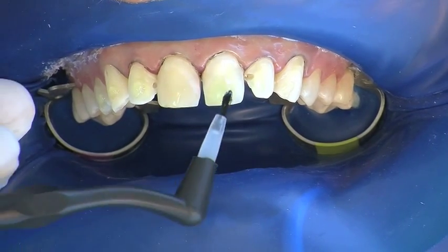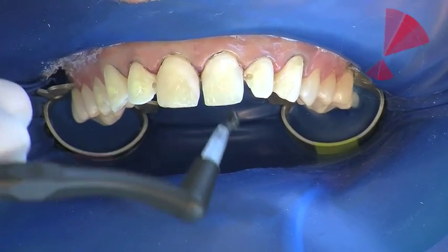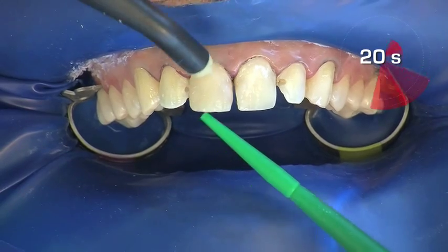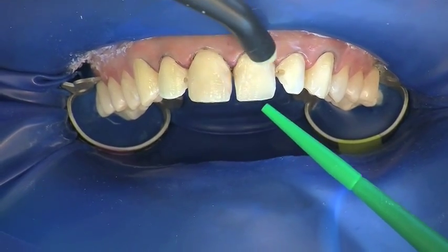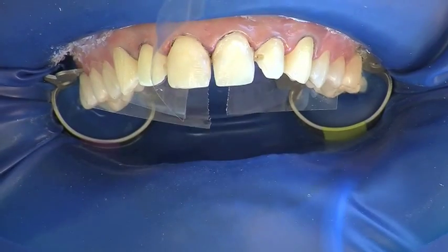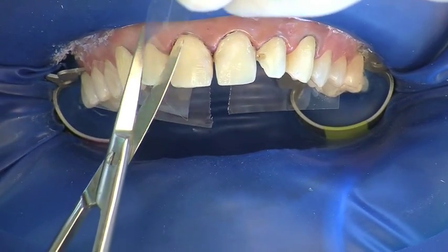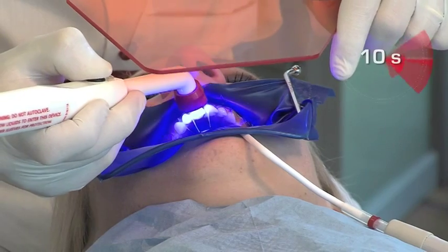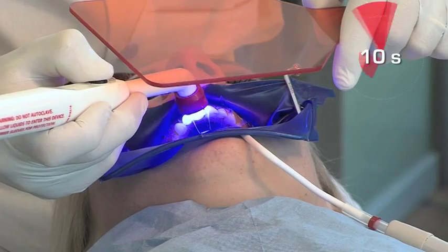One coat bond is distributed evenly to all teeth and massaged in. The reaction time is 20 seconds. The bond is then blown to a thin layer and excess bond is aspirated. Separators are now placed to ensure clear tooth access. Each tooth is pre-cured for 10 seconds.